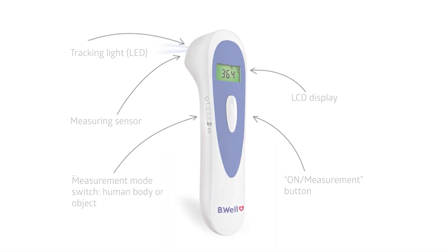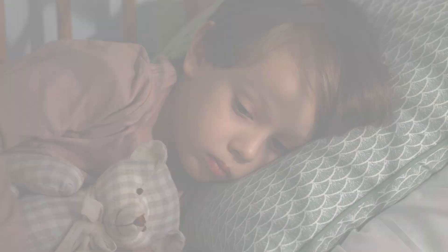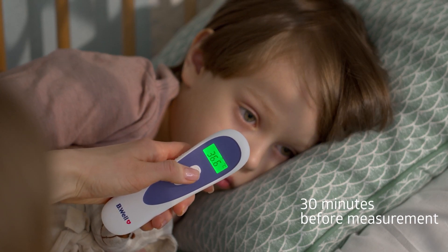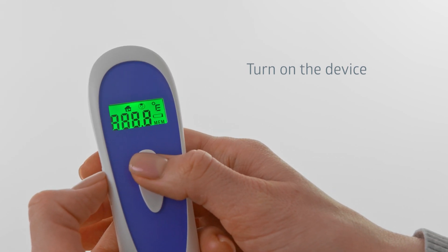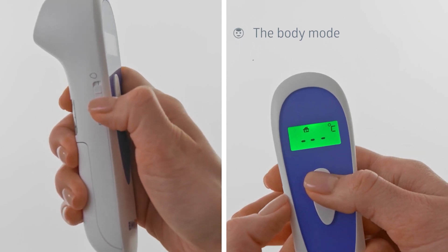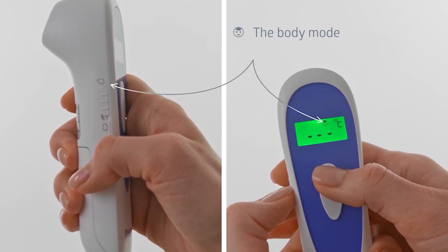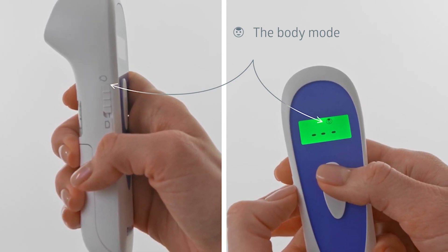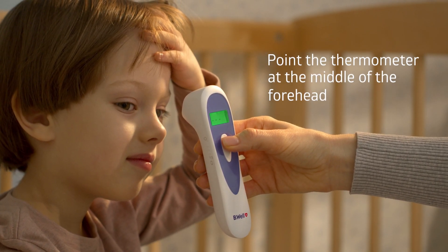Pay attention to the device controls. Both the thermometer and the person whose temperature is going to be measured must be in the same room for at least 30 minutes before measurement. Press the on/measurement button to turn on the thermometer. Use the switch on the side of the thermometer to set the body mode. The measurement mode icon will appear on the screen as a smiling face. Point the thermometer at the middle of the forehead.